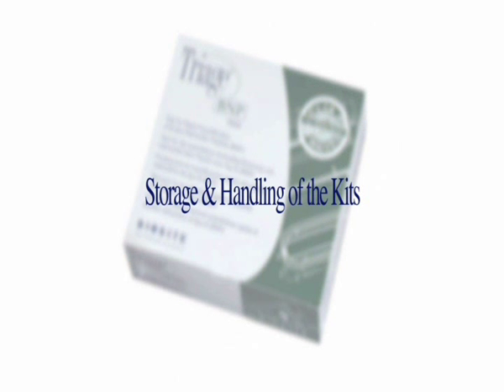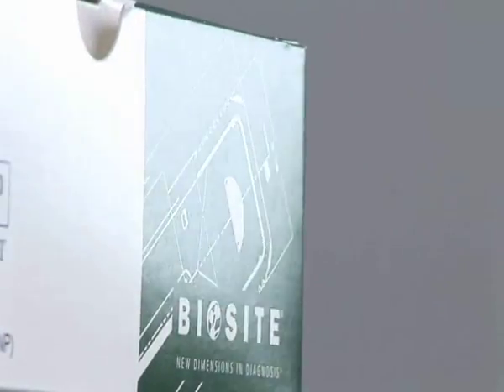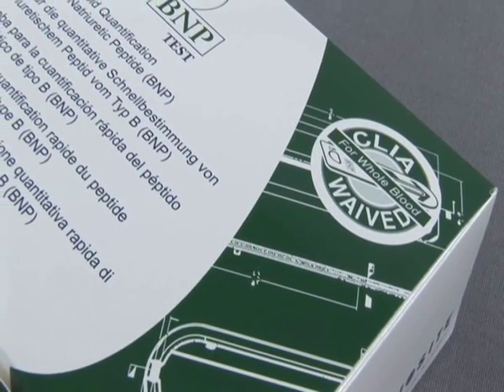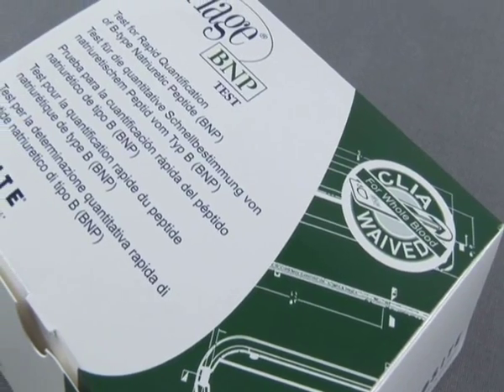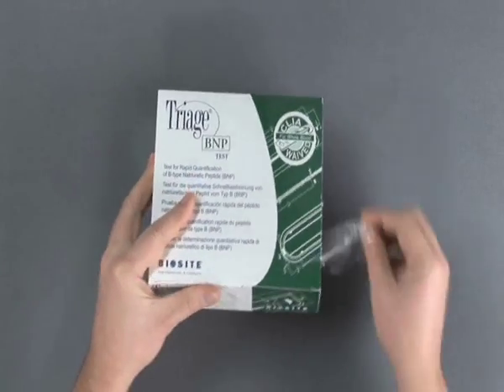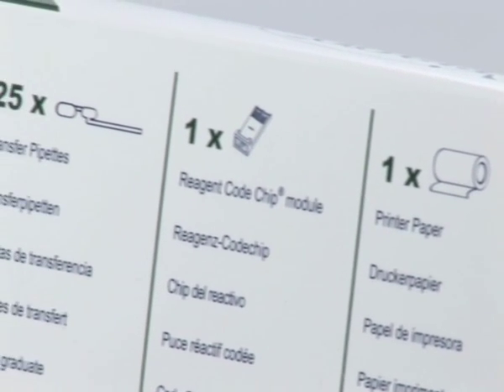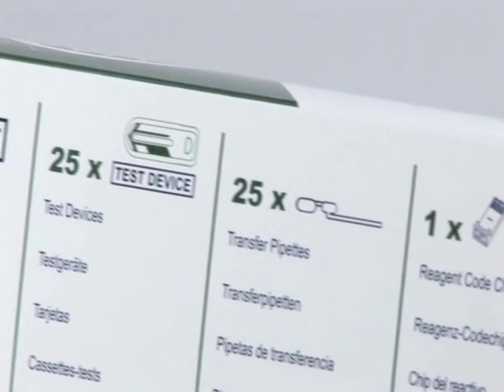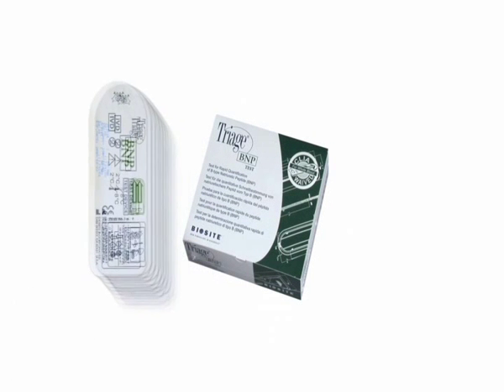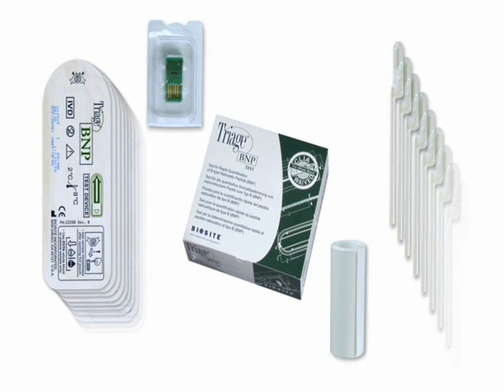Let's review the proper storage and handling of the triage test devices. The triage test kits come in clearly marked color-coded boxes. For example, green is the product color of the triage BNP. Each test kit is shipped sealed and needs to be opened when testing is ready to begin. Each kit contains enough supplies to perform 25 individual tests. Inside each kit, you have 25 test devices, 25 transfer pipettes, a reagent code chip, and a roll of printing paper for the triage meter.